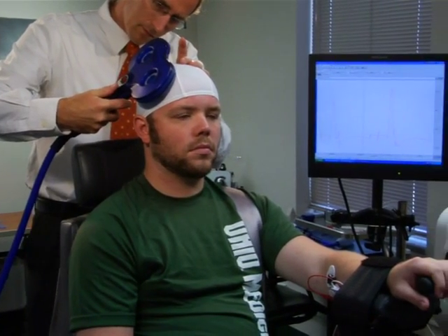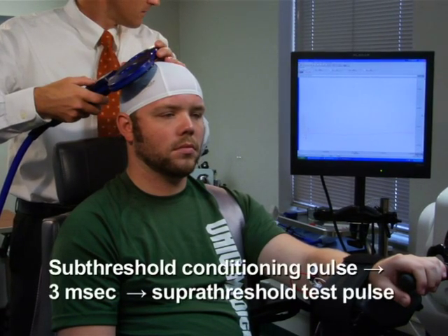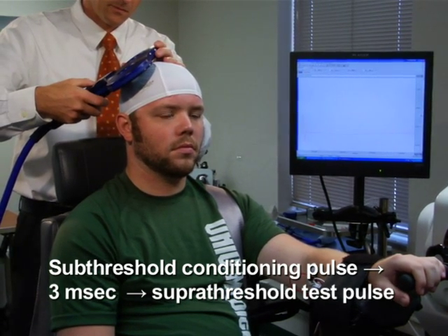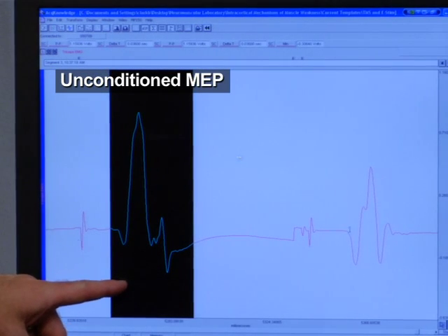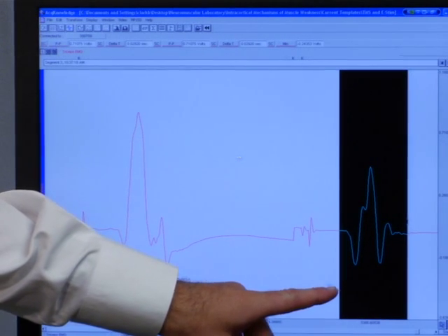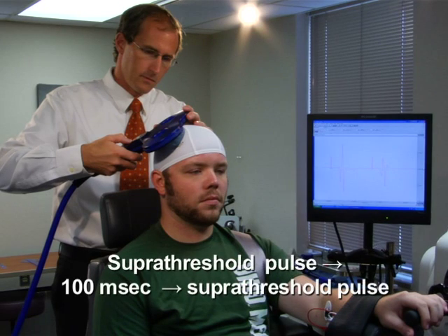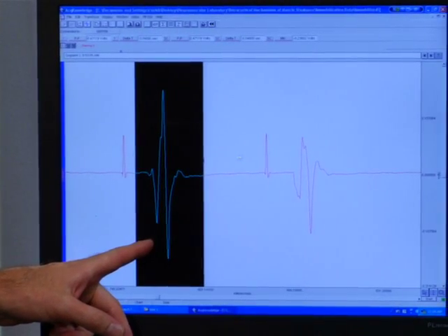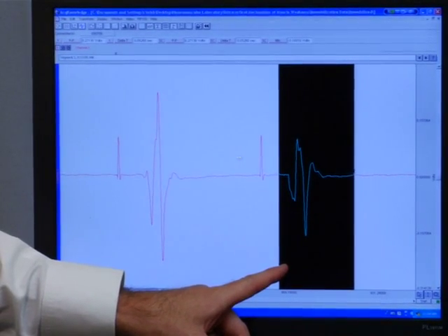Next, use paired pulse TMS to quantify short interval intracortical inhibition using the same procedure as described for measuring intracortical facilitation, with the exception that the interstimulus interval between the two pulses should be reduced to 3 milliseconds. The conditioning pulse delivered at this time period will decrease or inhibit the amplitude of the motor evoked potential more than a single unconditioned pulse of the same intensity. To quantify long interval intracortical inhibition using paired pulse TMS, deliver two identical suprathreshold test pulses separated by 100 milliseconds. For the FCR muscle, the motor evoked potential associated with the second pulse will be smaller or inhibited more than that associated with the first.